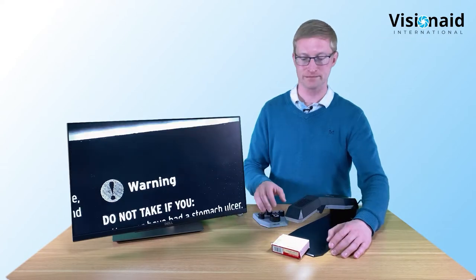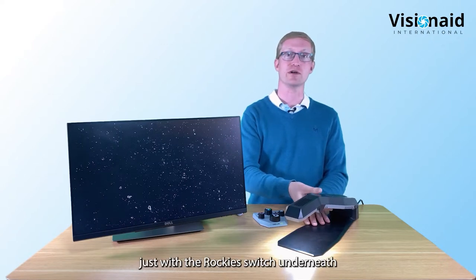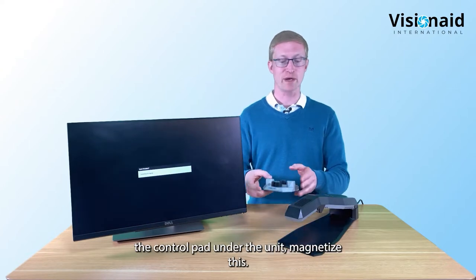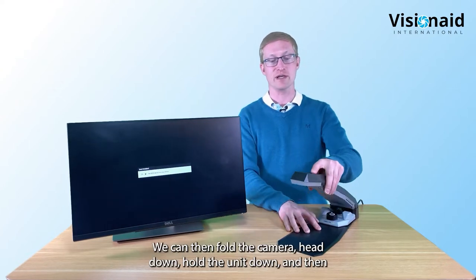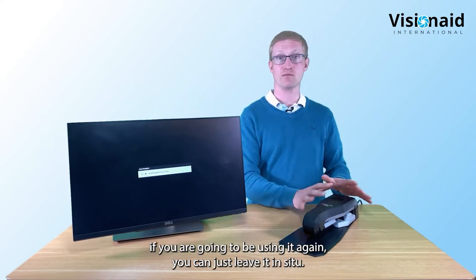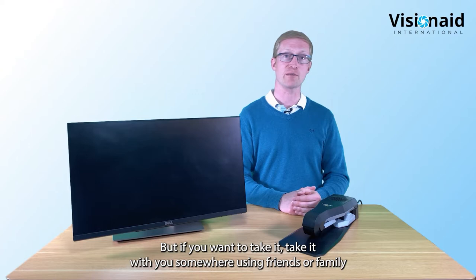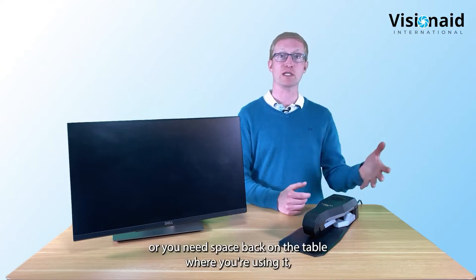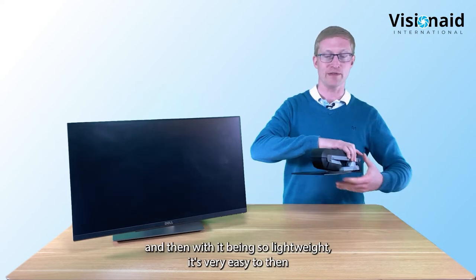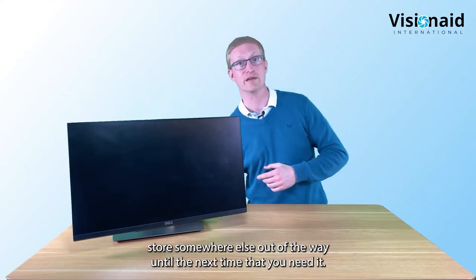When you've finished using your Helix HD, switch it off with the rocker switch underneath, store the control pad under the unit where it magnetizes, then fold the camera head down and fold the unit flat. If you're going somewhere or need the table space back, just unplug the two connections on the back. Being so lightweight, it's very easy to store somewhere else until next time.